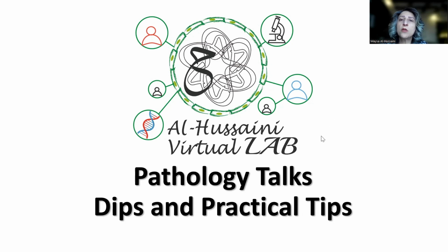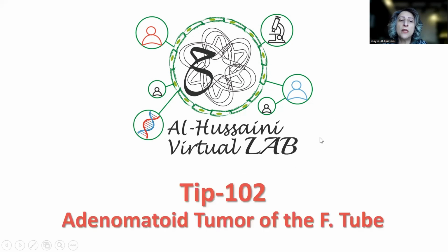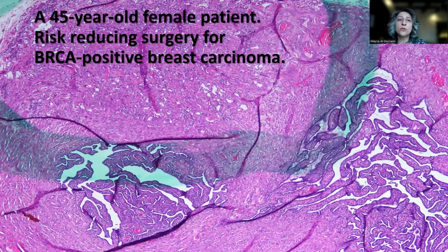What I'm going to be sharing with you today is a nice example of adenomatoid tumor of the fallopian tube. This is a case of a 45-year-old female patient who underwent risk-reducing surgery for BRCA-positive breast carcinoma. What they do with the risk-reducing surgery is bilateral salpingo-oophorectomy.